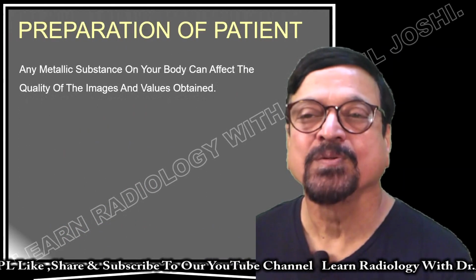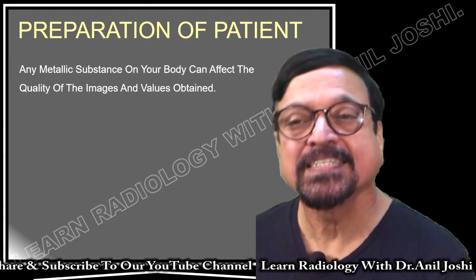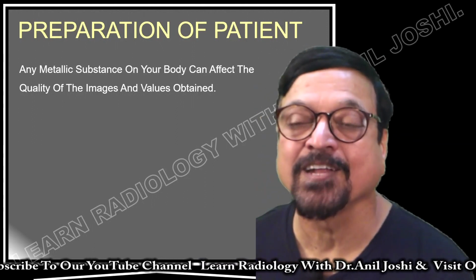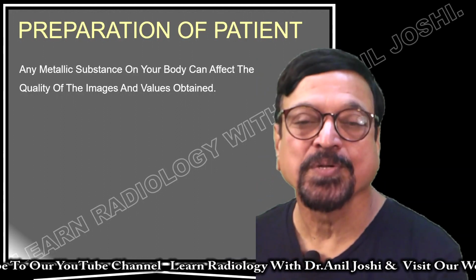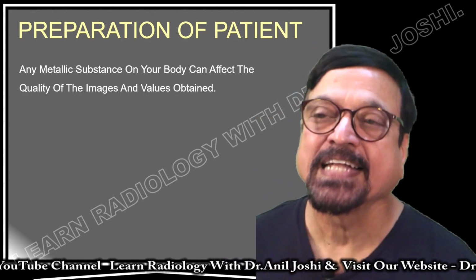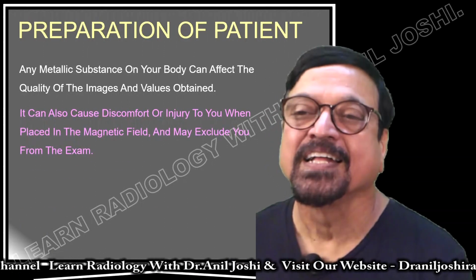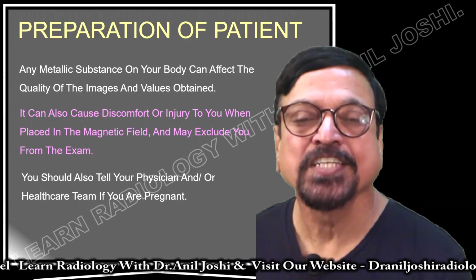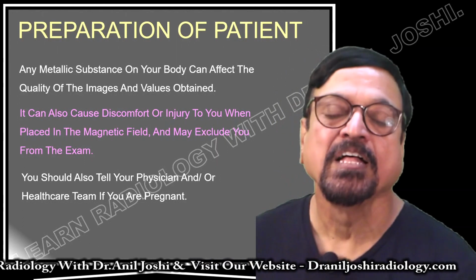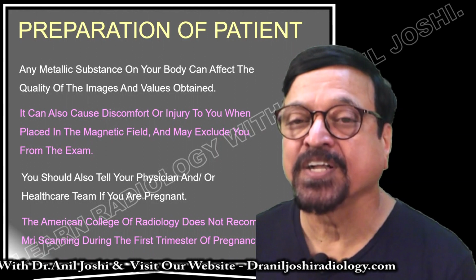Do visit our website, do see other lectures also in which we have given all these things, and how we test them is we have a metal detector and we move it over the body and know whether these things are there or not. But anyway, it is your duty to tell the patient. Then preparation of the patient: any metallic substance on the body should not be kept, no ornaments, no credit card, all things have to be kept outside, otherwise you will find that they are inactivated or they are not working properly, they are malfunctioning. Pregnancy should be informed because of the slightly different rules in different countries.